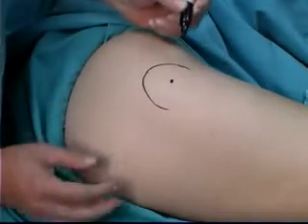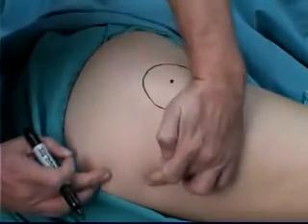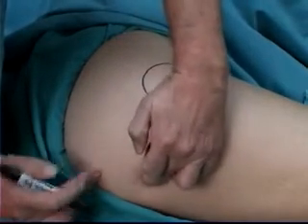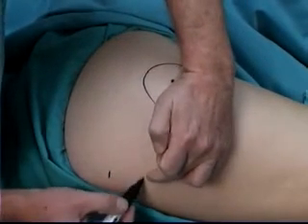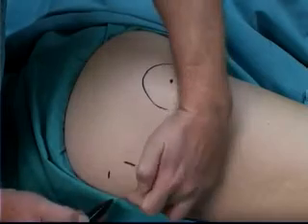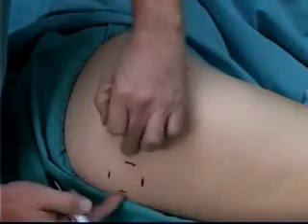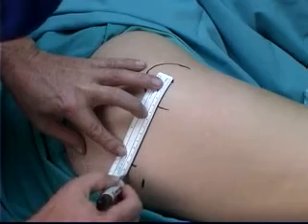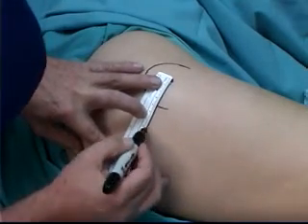The patient is positioned in Sims position. The semicircle here outlines the greater trochanter of the femur. Mark the midpoint of this and feel for and mark the midpoint of the ischial tuberosity. A line is drawn which joins these 2 points, and the midpoint of this line is measured and marked.